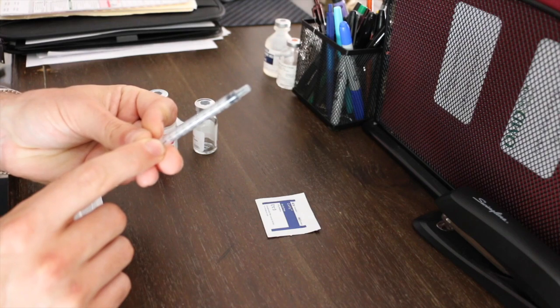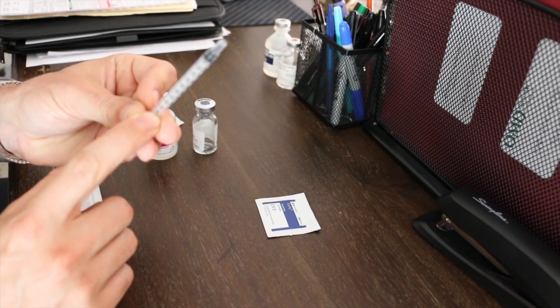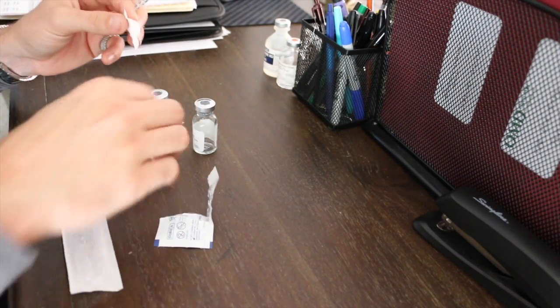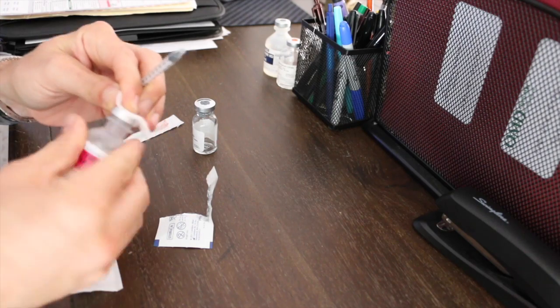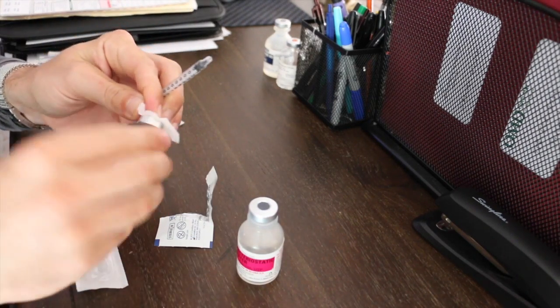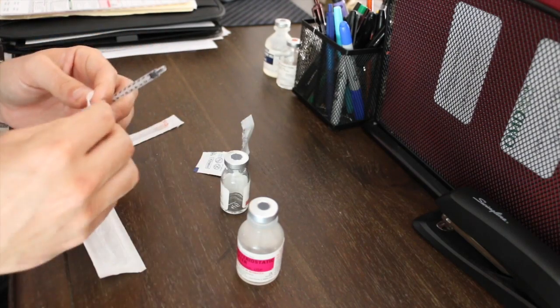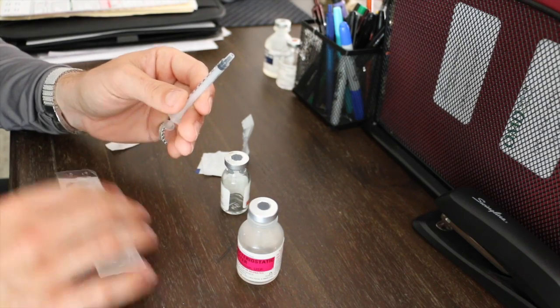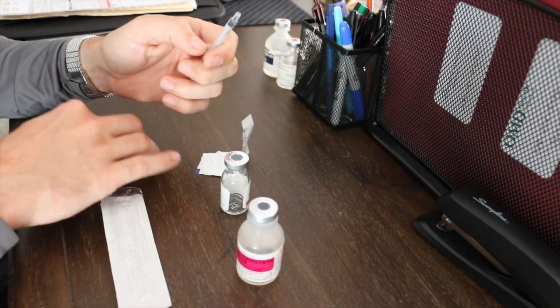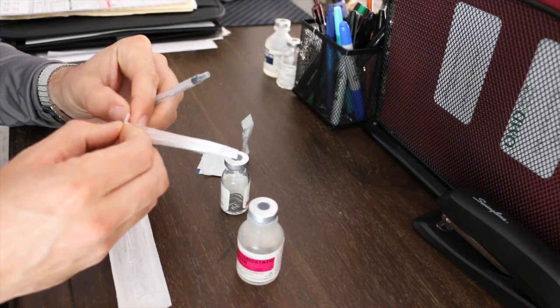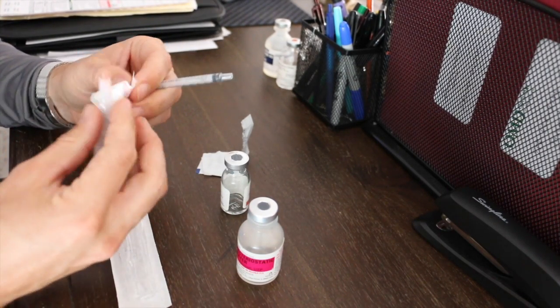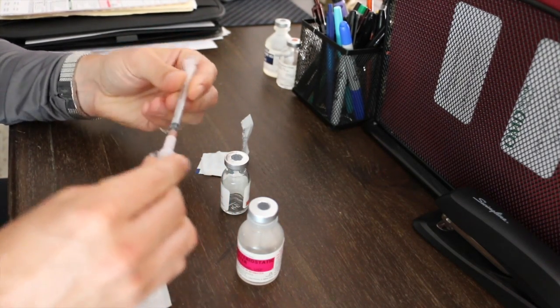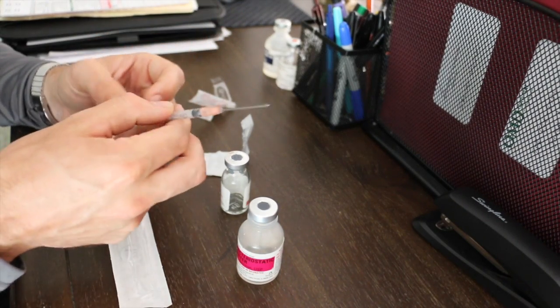First thing is keep it sterile. Wipe down the top of your bacteriostatic water with a little alcohol, same thing with whatever it is that you're injecting. Another important tip: don't touch the tip of the syringe. It's sterile when it comes out of the packaging. You might have gotten a package that has the needle already attached to the syringe, in that case you just have one less step. You just connect them.